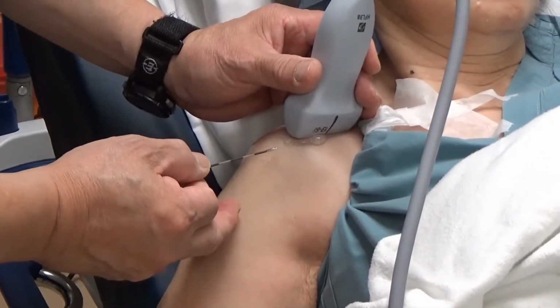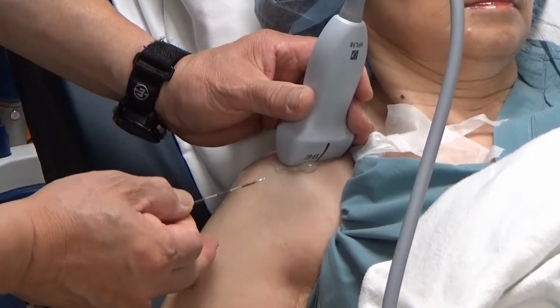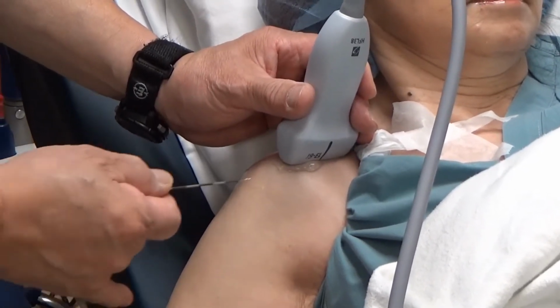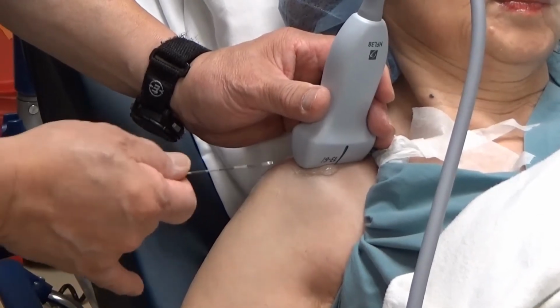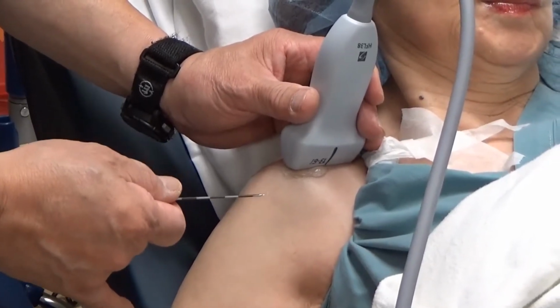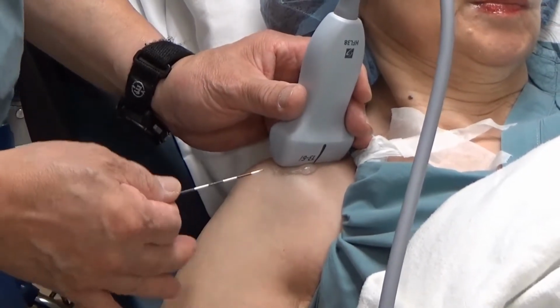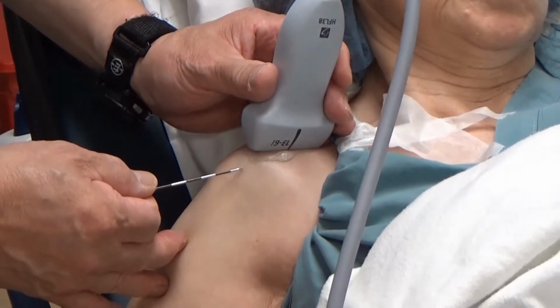Once I have contacted the calcium deposit, I begin my fenestration, which is basically advancing and withdrawing the needle, and then I angle the needle in multiple directions so I get different parts of the calcium. So this is the traditional way we do it in the in-plane technique.